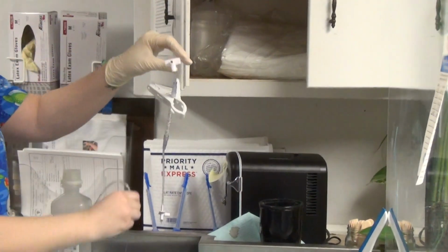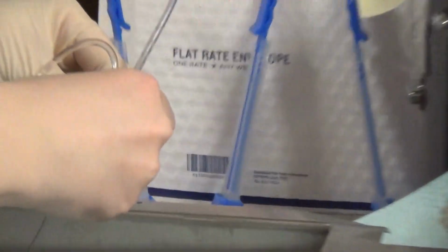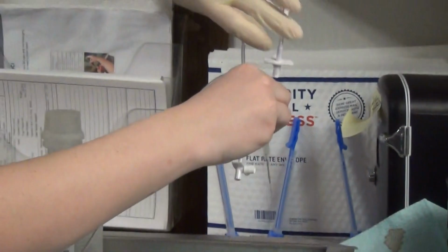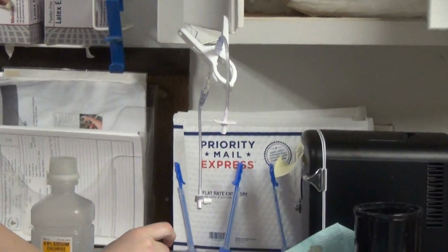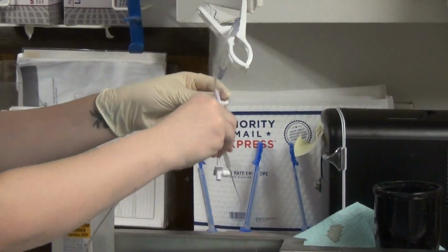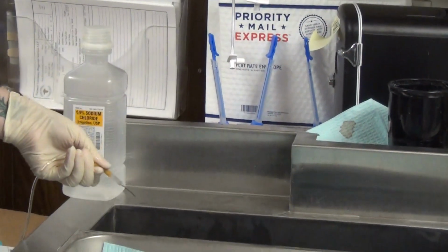And this will only be used again for the same pet, no other pet. Sometimes, if there's some little pits, there's stuff that you want to clean out of the little end pieces because the blood can clot within there. And so you're cleaning those little pieces out as well to make sure there's no extra blood that could work its way in there. So we're trying to utilize a sterile technique that is going to keep the cuvette clean, at the same time not have to have the owner buy a new cuvette each time, which helps keep their cost more reasonable.